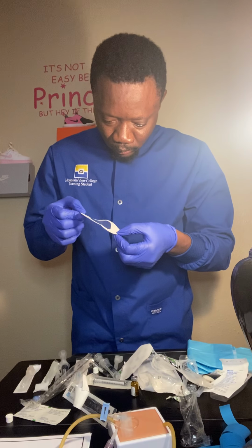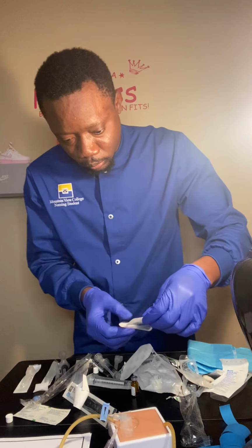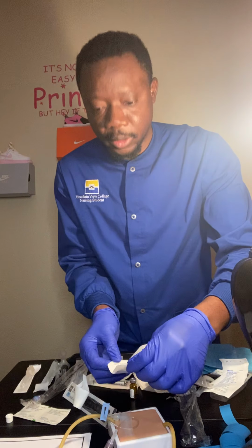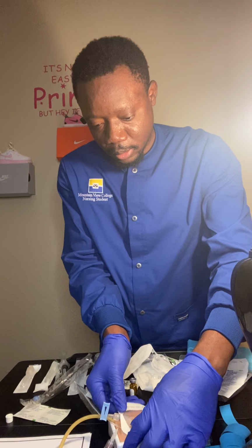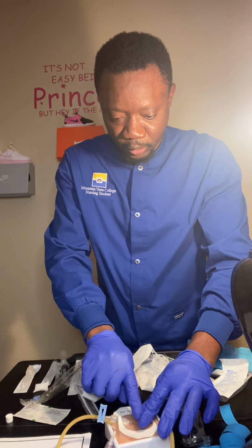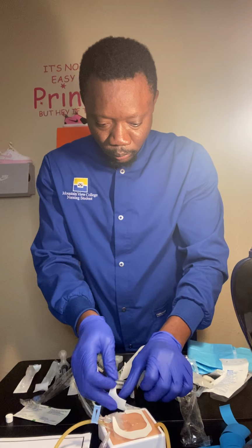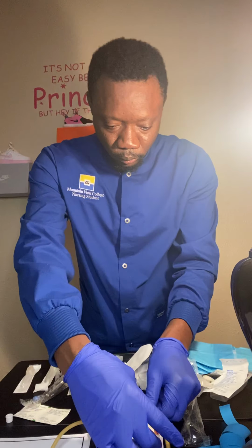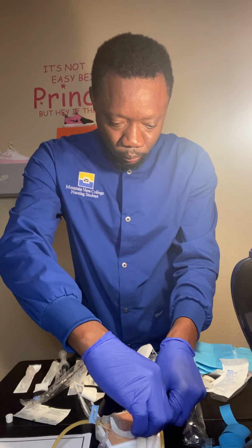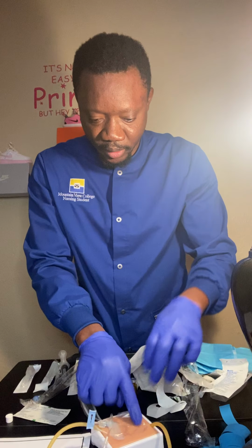Just to stick it up. So this is what I will use to secure the site in position. So I'm gonna put it. I know it will look cleaner if I'm doing it on someone's arm. This is so small.